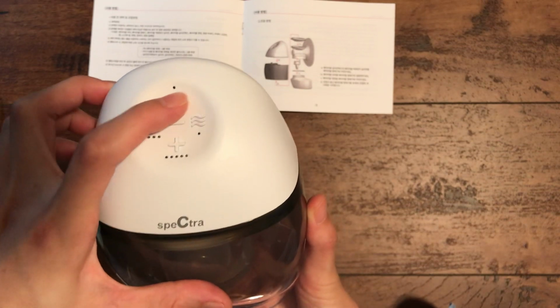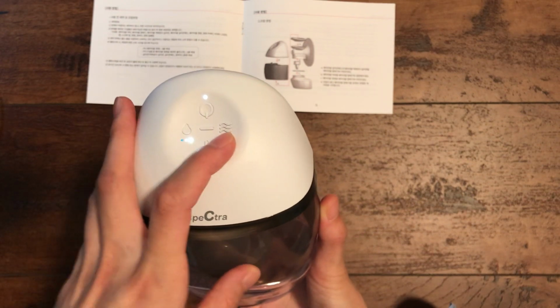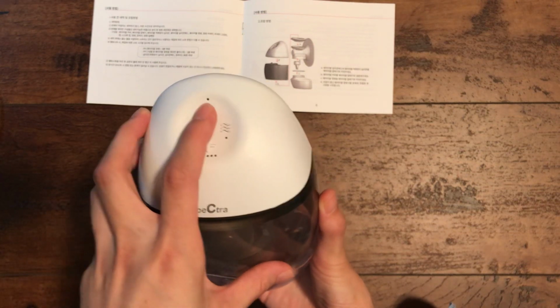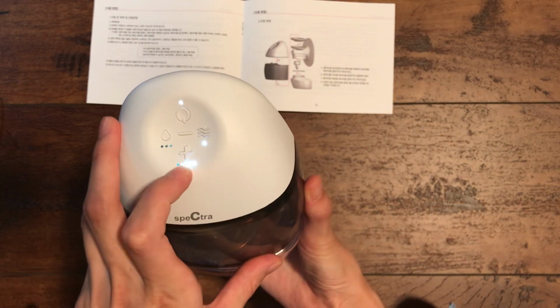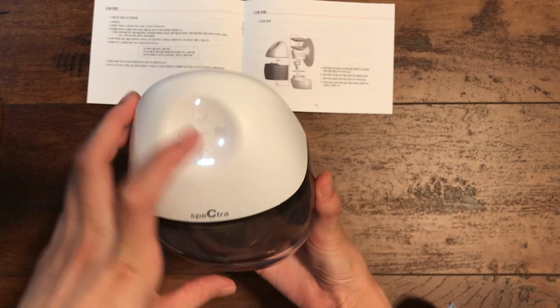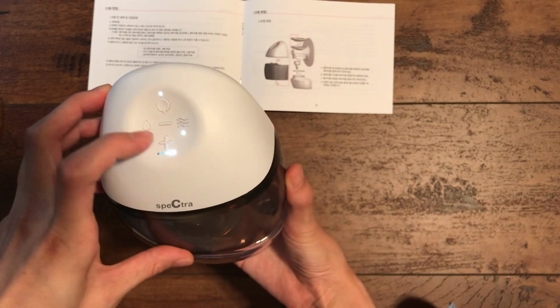So when you first start, it goes straight to the expression mode. It never goes to the massage mode first. Same with the Spectra S1 or S2. So you have to press this button to go to the massage mode. So you click it, and then you can increase or decrease the intensity of the massage mode. It remembers the last intensity that you used, which is pretty nice. I personally use the third level, but it really depends on your preference.